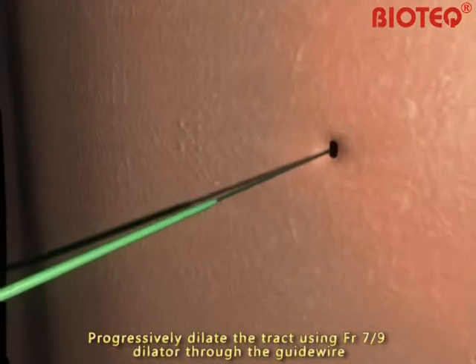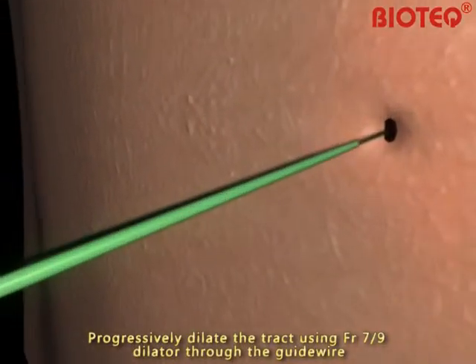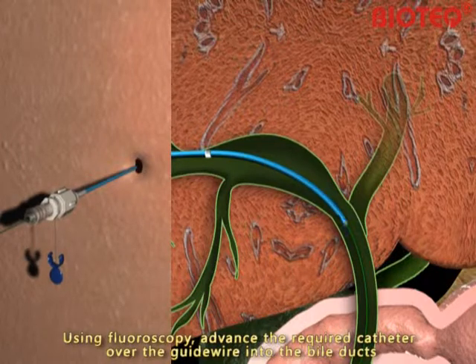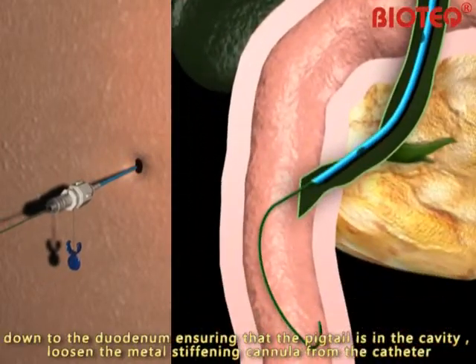Progressively dilate the tract using a French-gauge 7 to 9 dilator over the guide wire. Using fluoroscopy, advance the required catheter over the guide wire into the bile ducts down to the duodenum, ensuring that the pigtail is in the cavity.